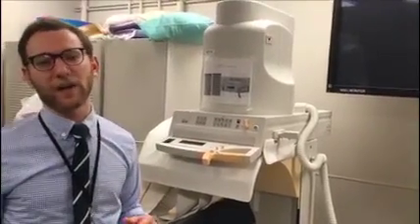The room can also have a warning light outside the room that allows other healthcare providers to know that there's live fluoro being done inside the room. The fluoro tables usually have an audible alarm. By convention, we do a 5 minute audible alarm of elapsed fluoro time, just to let you know that you're using a high amount for that procedure.